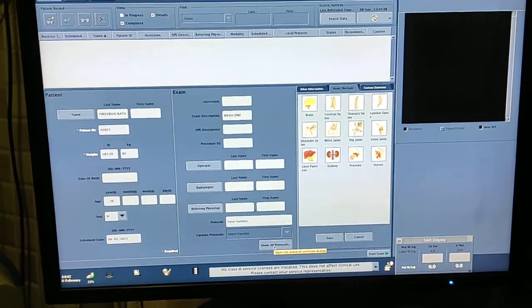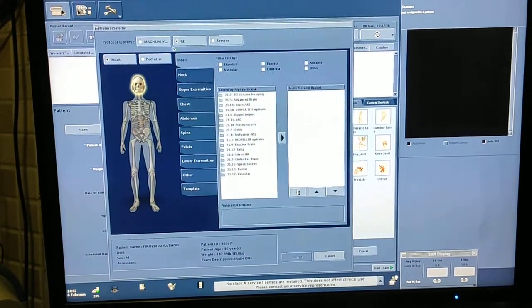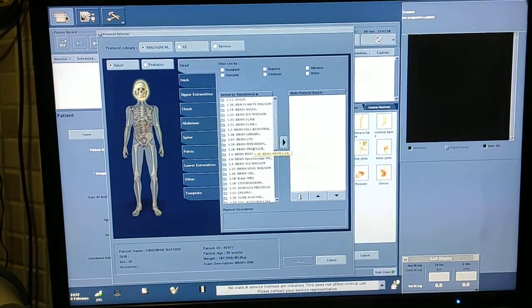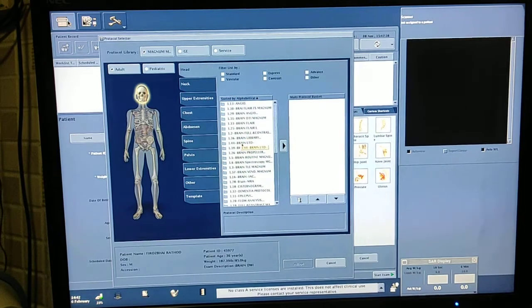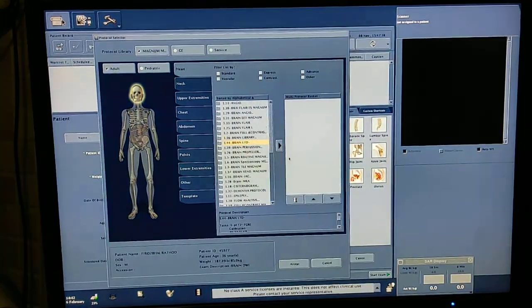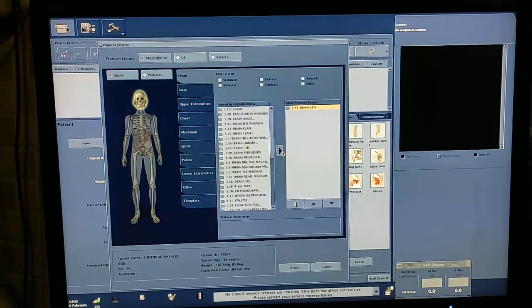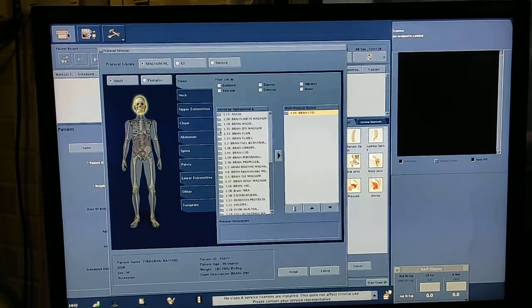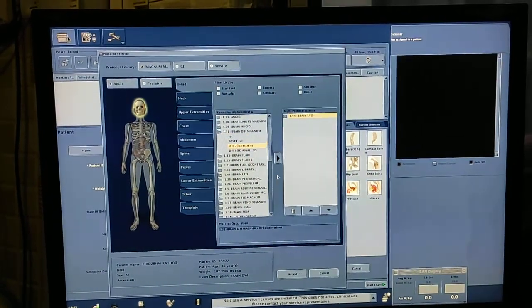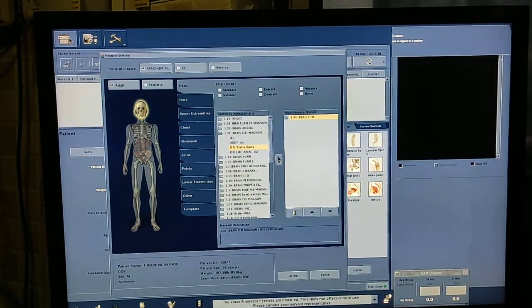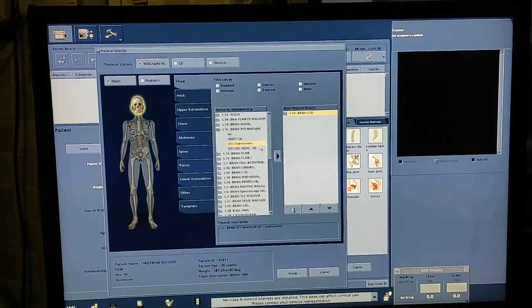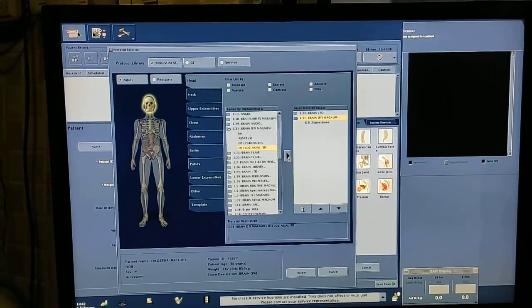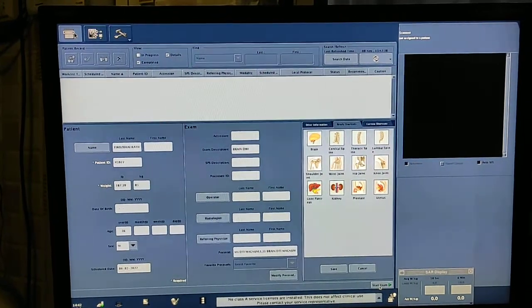From here you have to select the protocol. First I will select brain protocol and include one sequence of Diffusion Tensor Imaging. I am entering the DTI 25-direction sequence and DTI localizer axial 3D — enter, accept, start exam.